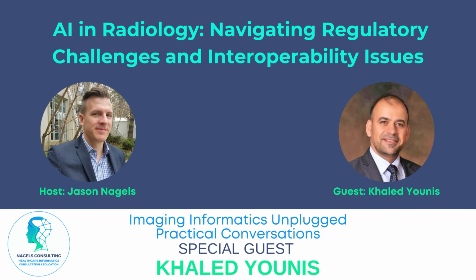The process was already examined by another company, R2, which is now Hologic. And Maryellen Giger from the University of Chicago was one of the pioneers in convincing the Radiological Society that CAD markers can act as a second eye, and it helps the radiologist not to miss some real cases of cancer.